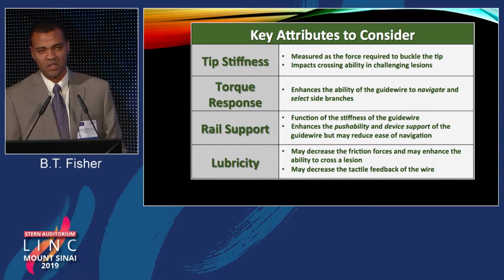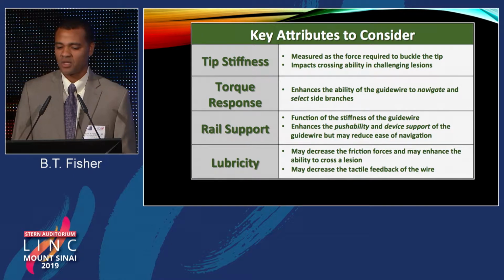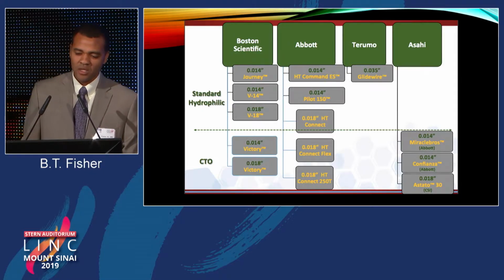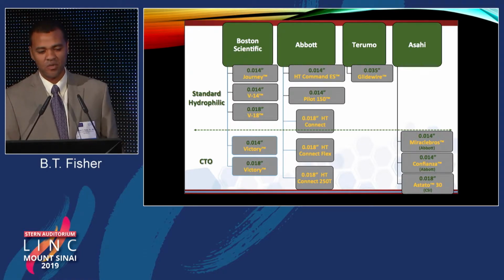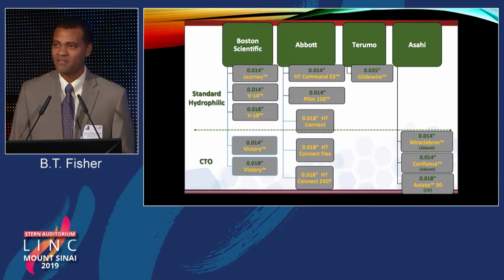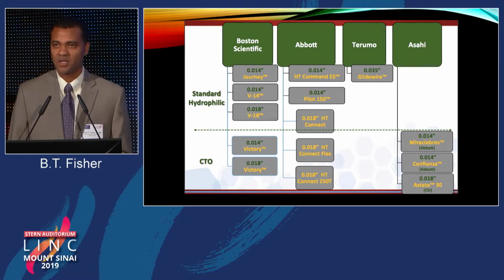This can often be overcome by trying to predilate the area that your wire is going through. But again, that lubricity is an important characteristic. There's a multitude of wires that can be used, and I think the biggest advice, if I were to give that to anyone, is you pick the wires that work best for you. You have a set of 4 or 5 that really work well for you, and use those and learn how to make those dance. Again, there's a plethora of options available.